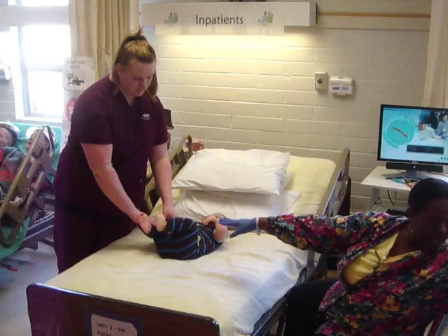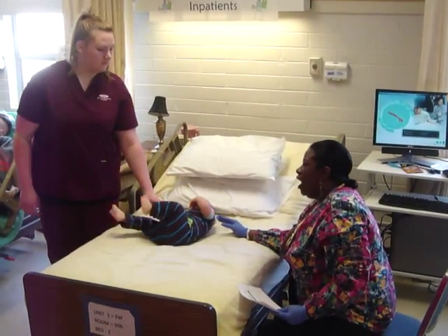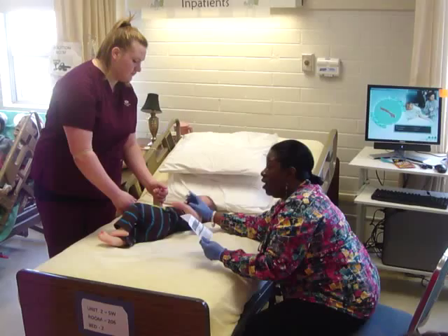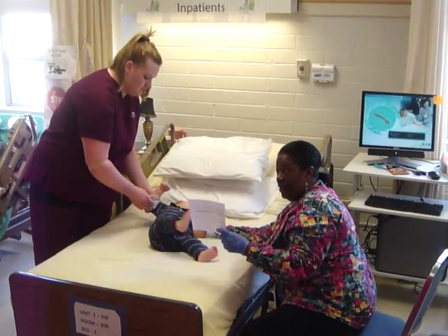The proper ID and everything has been established. The interesting thing about ID with a baby is that if the mom is there, on the requisition it's going to have the mom's name as well as the infant's name.